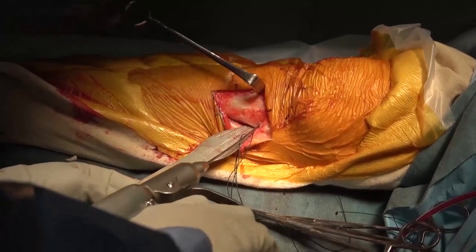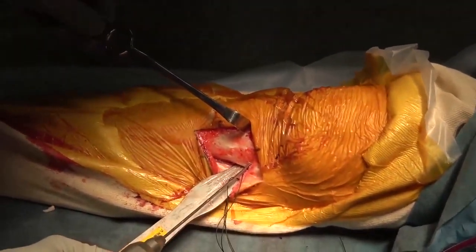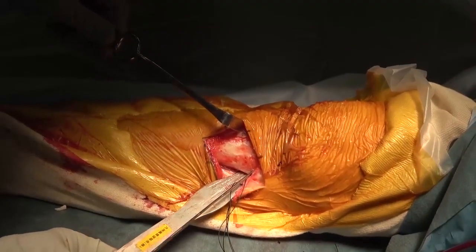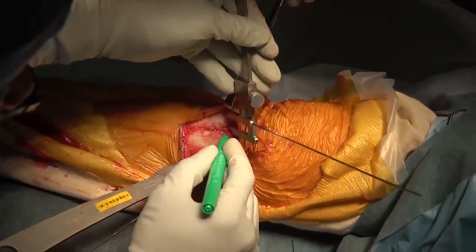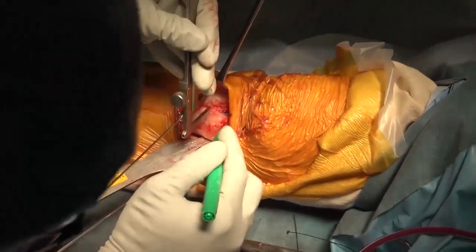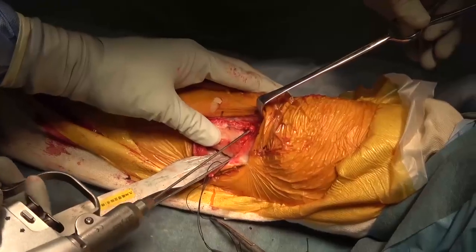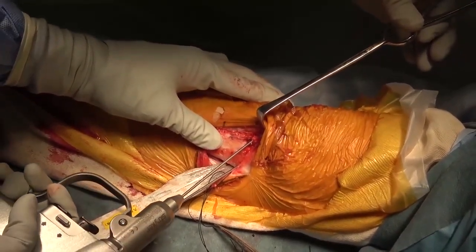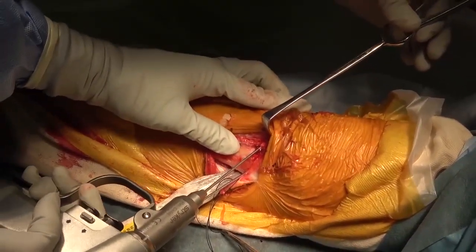After the osteotomy site is exposed, a first guide wire of 2 mm K-wire is inserted 40 mm below the medial articular surface of the proximal tibia towards the tip of the fibular head. Using calipers, a line located 15 mm thickness from the anterior edge of the tibial tuberosity is confirmed as a reference for the descending osteotomy. A second guide wire is inserted at the intersection between the transverse osteotomy and the descending osteotomy, penetrating cortex bone just below Gerdy's tubercle.